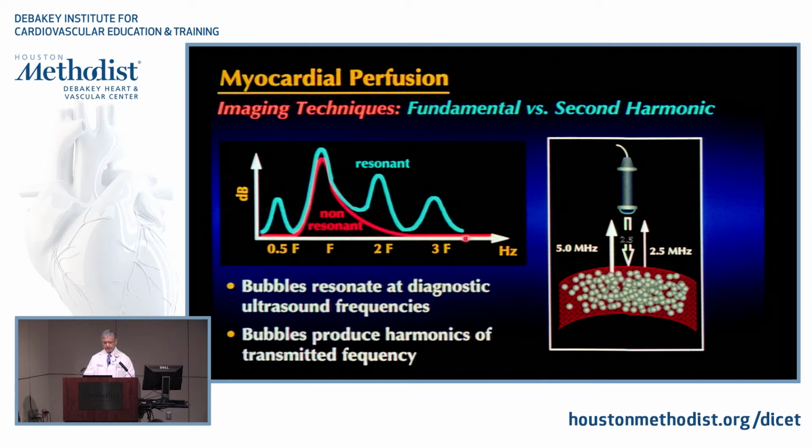I'll give you an example. If you take a string, if you're a piano player or a guitar player, you can hit the string nicely, and you'll hear its fundamental frequency. Ping! No interference. It's exactly the same one. But try to deform it a little more. Hit it very hard, okay? You will have the fundamental frequency and multiples of it. These multiples are at a lower amplitude, but they're multiples. I'm going to simulate it here. So you'll have multiples of them, either in the subharmonic or the high harmonic.